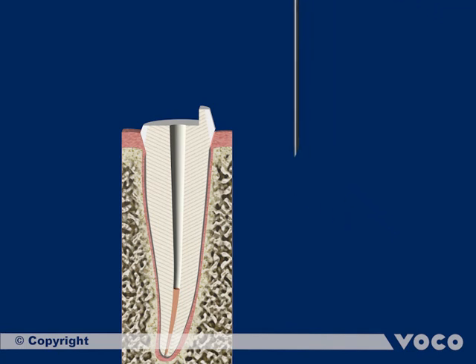The root canal is then cleaned by rinsing it with water. Remaining water is removed with a paper point.